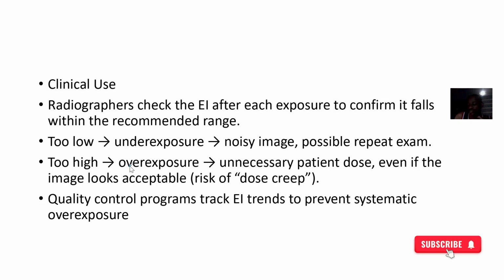All right. So quality control is always to be ensured so that it's within range. It's within what is accepted.